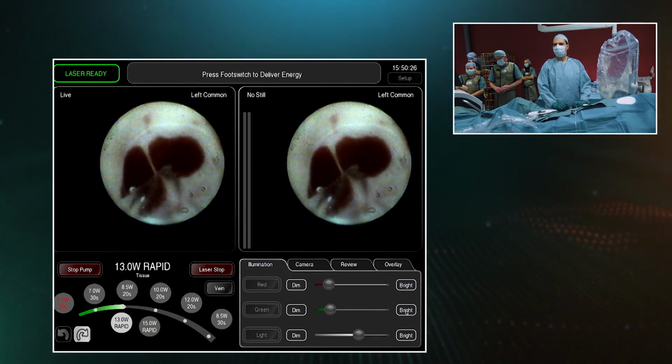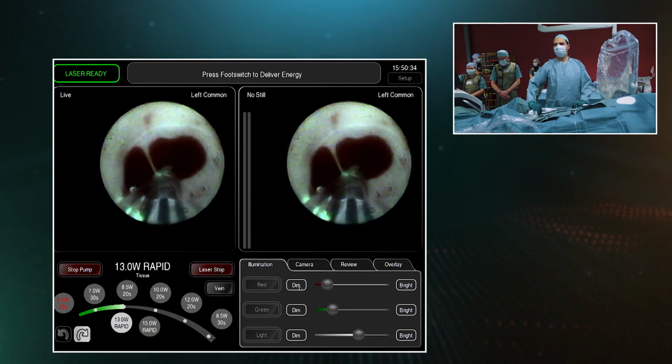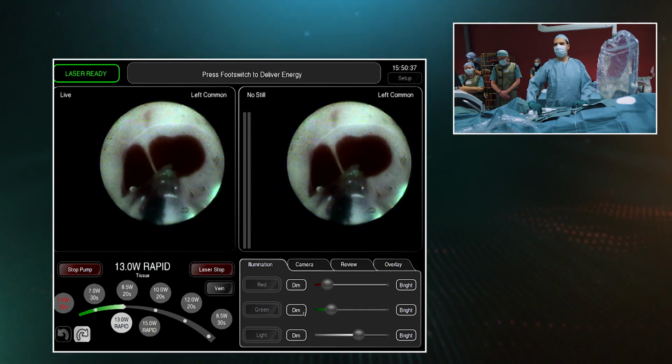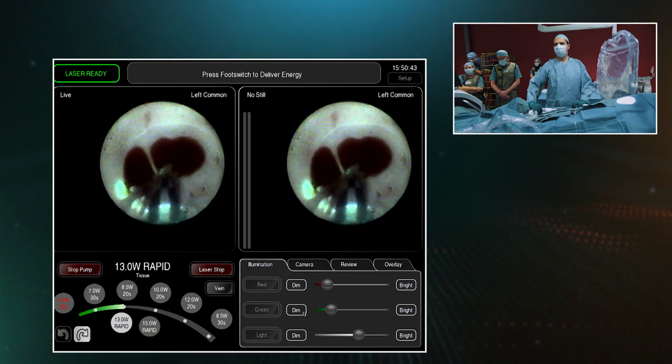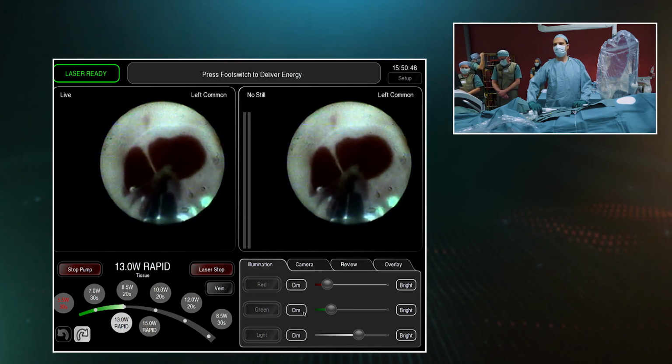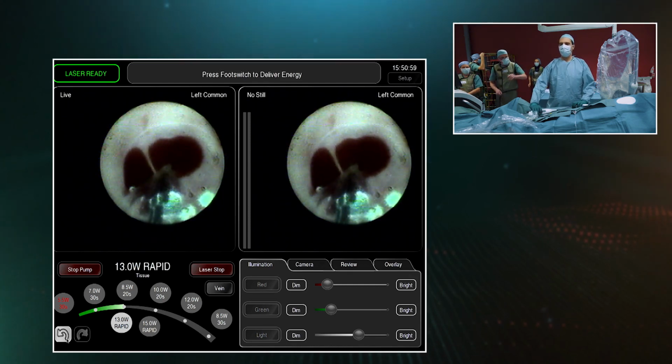So at this point, of course, we should be able to do one big swoop. I can rotate the laser beam to have a trial run, if you will, here to see if it goes through. Here I need to be a bit careful because on this side the vein is a bit more proximal than here. So what I'm going to do is start here on this end so that the tricky part ends up being last on my ablation. I'm sorry? No, I want to do counterclockwise and do the blind spot in the end.